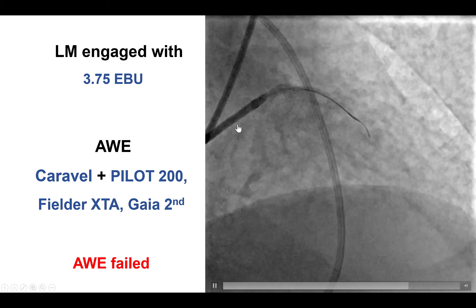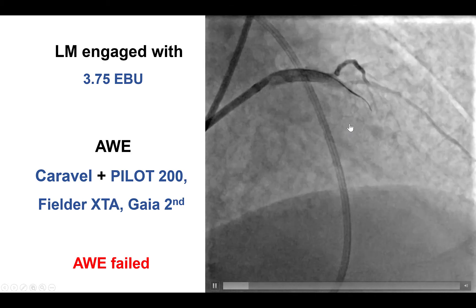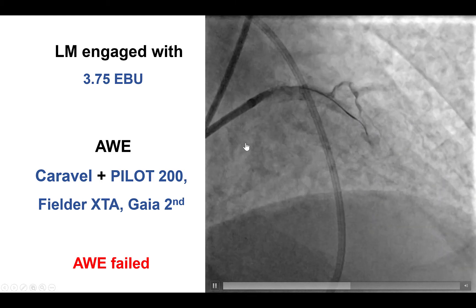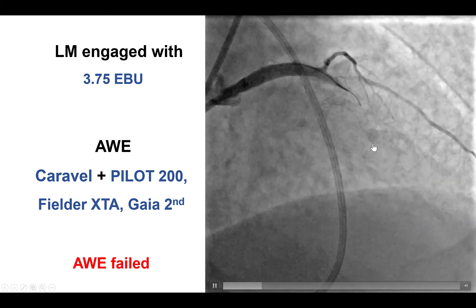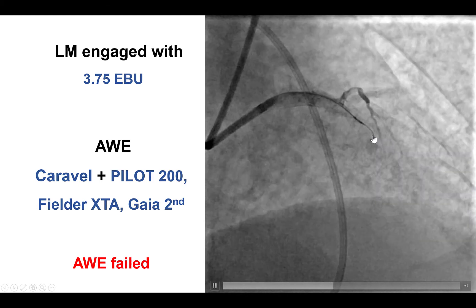An 8 French 3.75 EBU guide was used, and antegrade wire escalation was performed with Pilot 200, Fielder-XT, and Gaia-Second, but it was unsuccessful and the wire actually entered the sub-intimal plane.